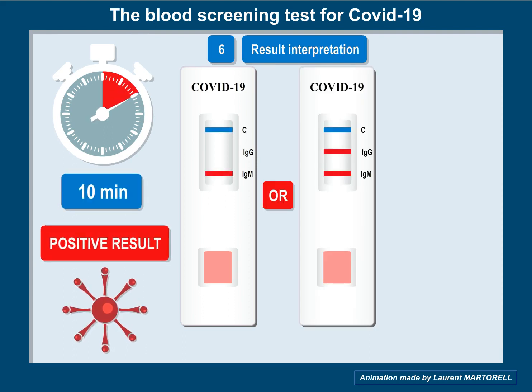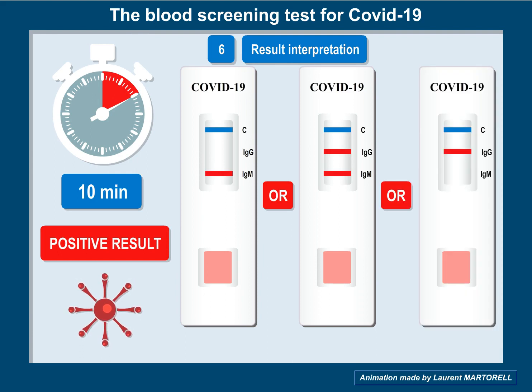Result interpretation: if one or two red-colored lines appear along with the blue-colored line, which is the control line, the test is positive. You can assume you have been infected by COVID-19.